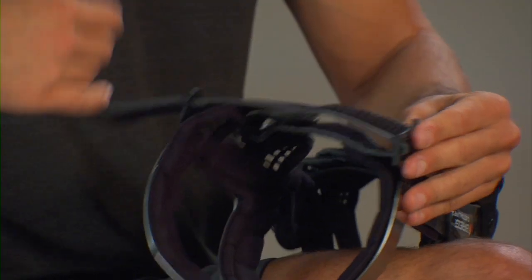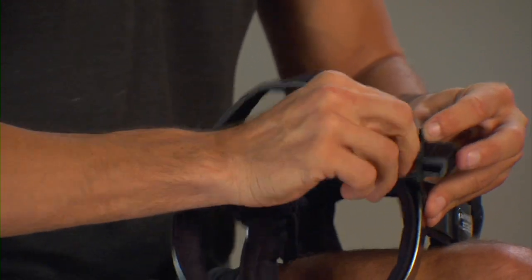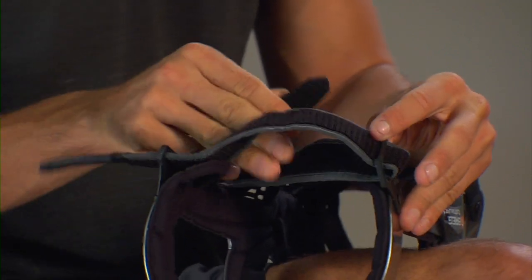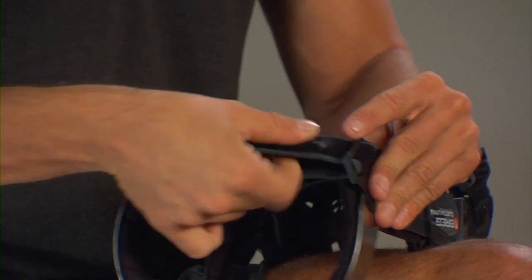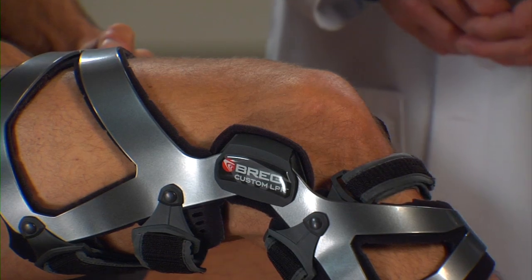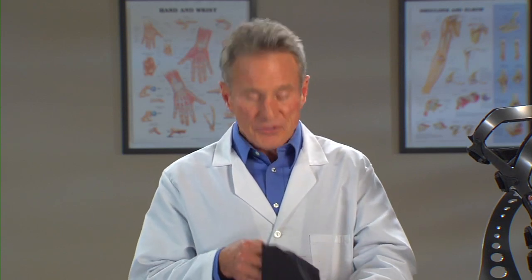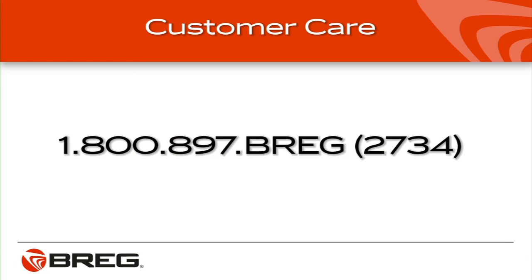LPR knee braces are designed to be easy to use, but there are a few tips that might help with fit and comfort. If the straps are too long, adjust the straps accordingly. You may find that the brace straps stretch after prolonged wear and heavy perspiration. Make sure to err on the side of placing the hinges further back on the knee rather than too far forward — this will help ensure the brace stays in the correct position during the strapping process. Wear an undersleeve for the first few days to allow your leg to adjust to the brace. To order an undersleeve, call Breg Customer Care at 1-800-897-BREG — that's B-R-E-G, 2734.